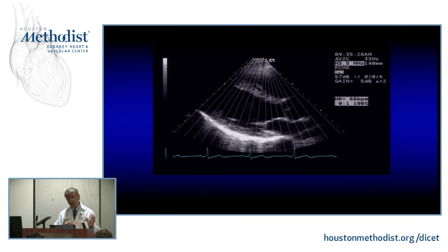But over time, things have evolved significantly so that you can do parallel processing, so that nowadays even for a 90-degree sector, you can get frame rates in the 120s, 130s frames per second, which is very good, really close to real time. Contrast that with other technologies like CT, MRI, right? And this is the importance of real-time imaging, which is very close to real time nowadays with 2D. Color Doppler is a little different ballgame, it drops your frame rate. 3D drops your frame rate, so we have to talk about that. So you have to think about temporal resolution.